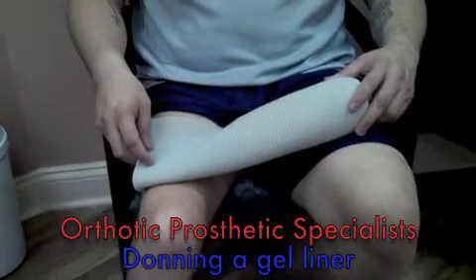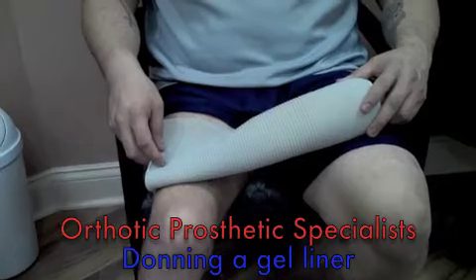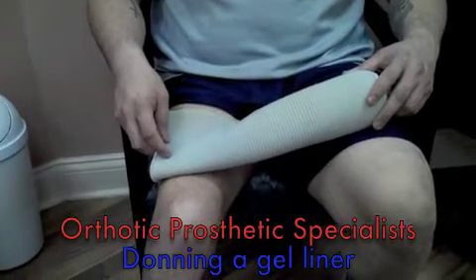This video is on the donning of a gel liner for a 3S prosthesis system.